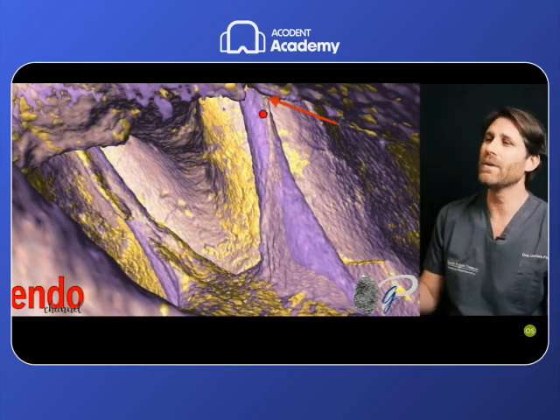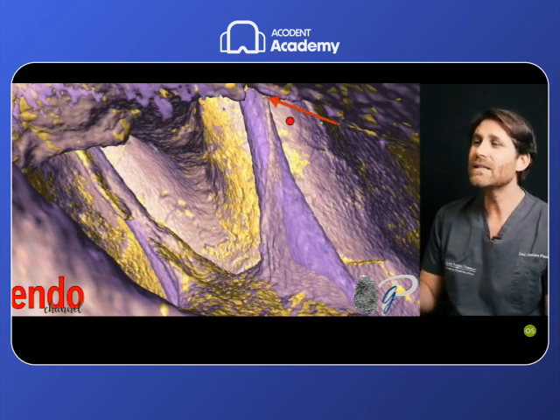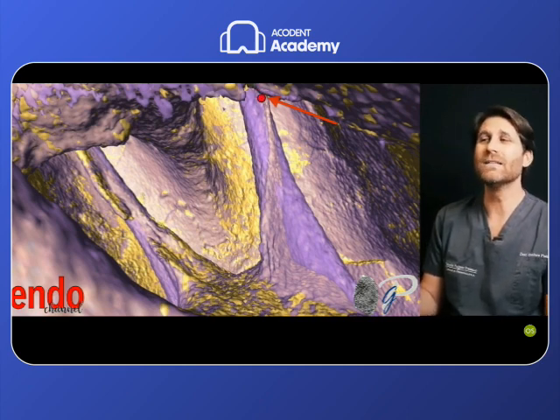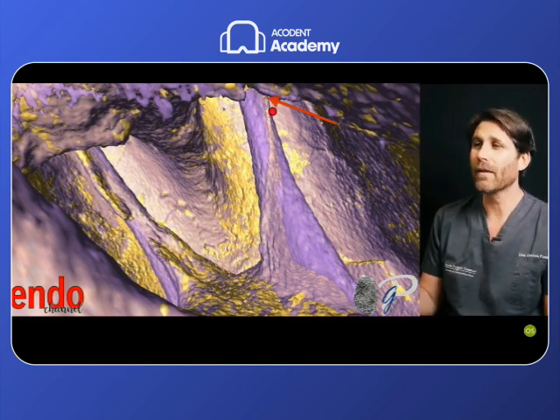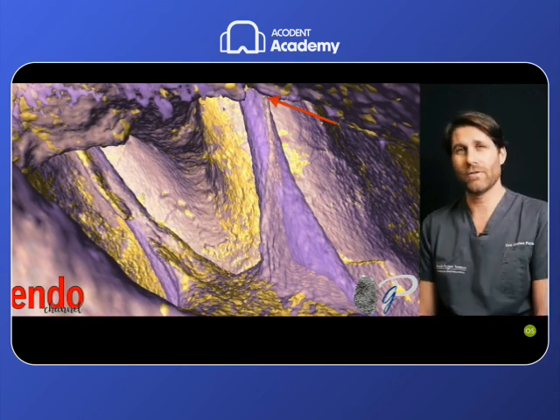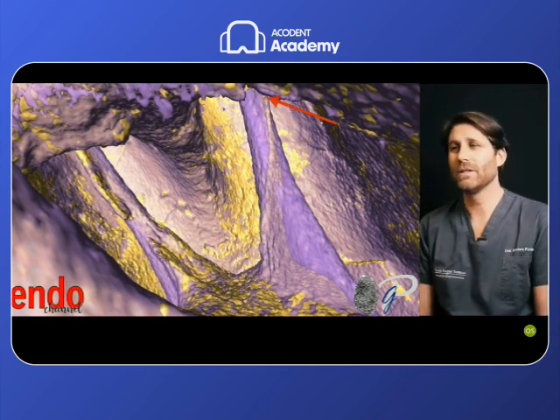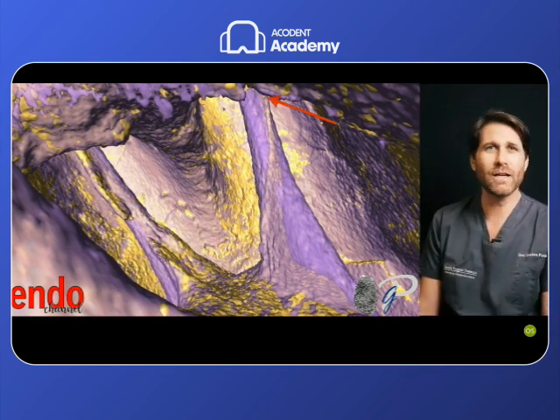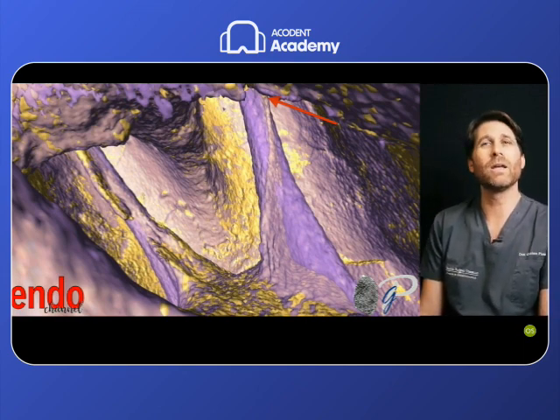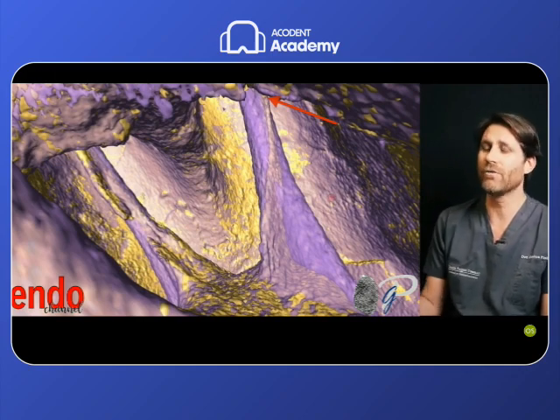This is because of the presence of this anatomy, this trajectory, and this point of coronal curvature in which the tip of the stainless steel file is rigid, touches and stops, and risks creating an iatrogenic error. So with manual scouting, it's difficult to perform this scouting, and this is the experience of all clinicians: with manual files we usually stop at 2-3 millimeters, and then we cannot scout the MB2 root canal more than this distance. This is the reason.